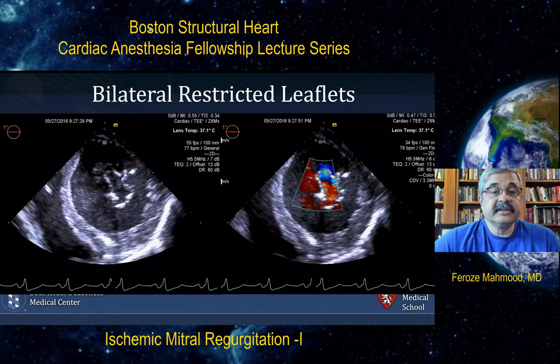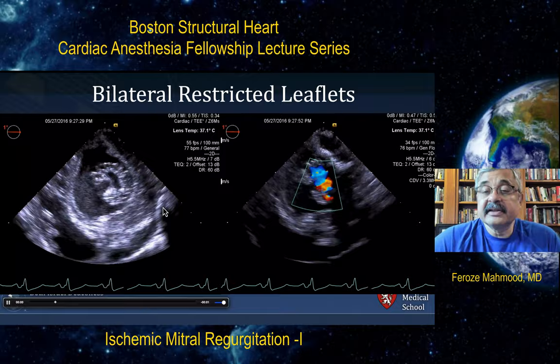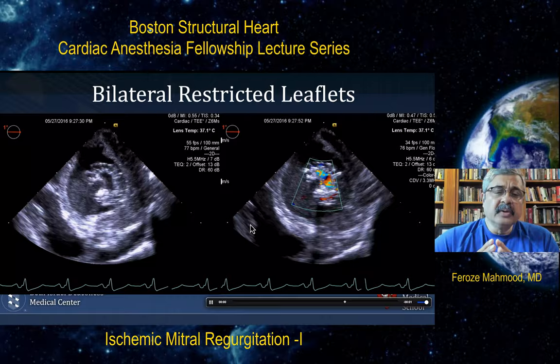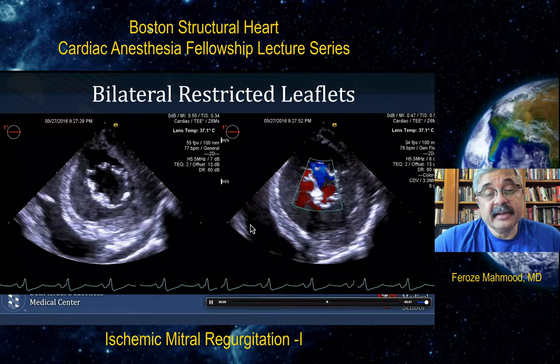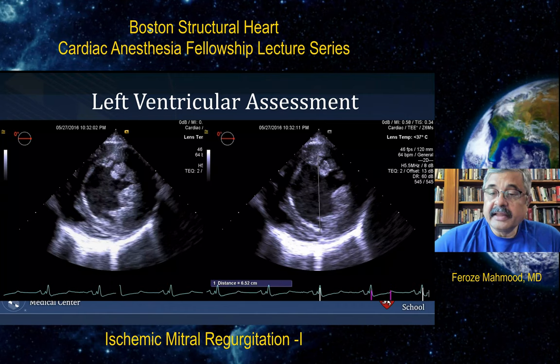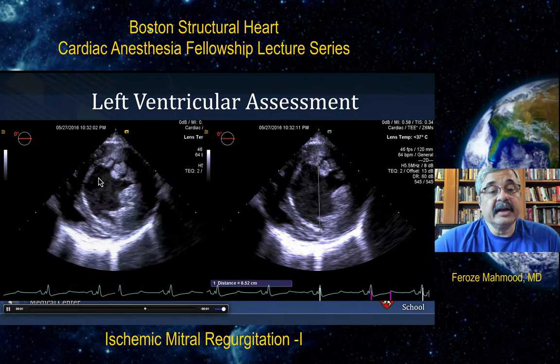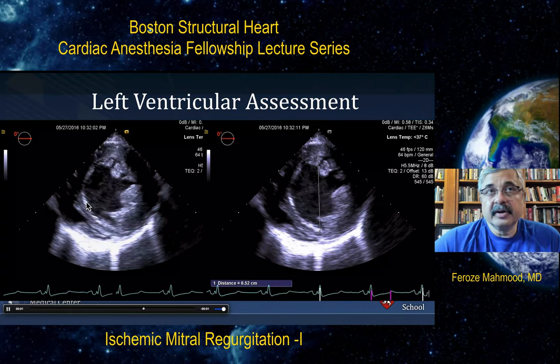When you look at the transgastric basal short axis view — commonly known as the fish mouth view of the mitral valve — it clearly demonstrates tethering of the leaflets leading to a significant coaptation defect with central mitral regurgitation. Normally you don't see this much leaflet tethering in the transgastric basal short axis view, but in this patient this pathology is quite easily visible as bilateral leaflet restriction. Looking at the left ventricle, ventricular function is severely depressed, it is dilated, and the anterior and postero-inferior walls are significantly hypokinetic, almost akinetic, with the septal wall possibly dyskinetic as well.